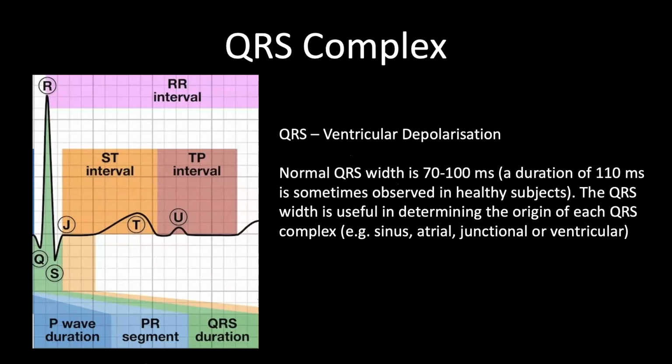That's quite high, quite postgraduate stuff, but just be aware that's why the QRS complex is important, but also think about your tachyarrhythmias. Your narrow complex tachyarrhythmias, such as SVT, supraventricular tachycardia, or your broad complex ones, such as ventricular tachycardias. And there are lots of other types of complexes that affect the QRS morphology, some of which we'll touch upon next week.